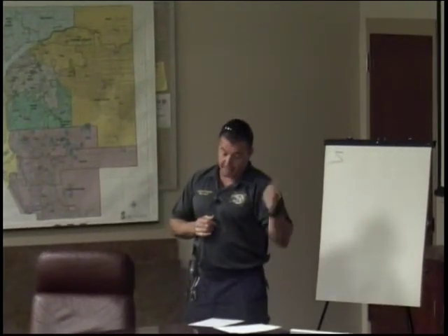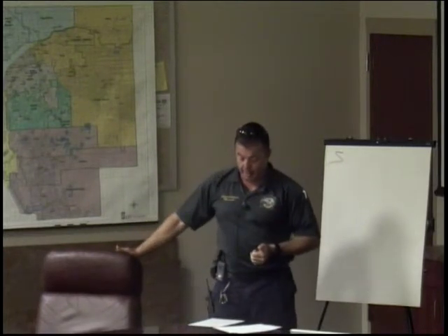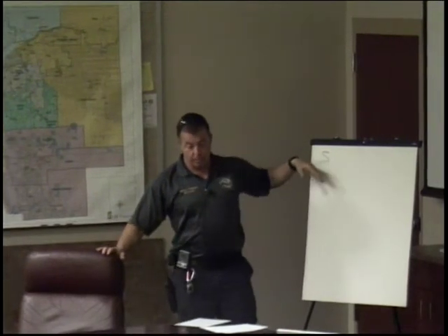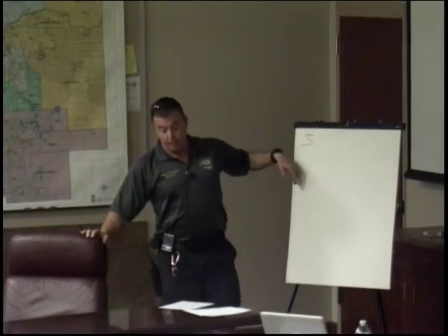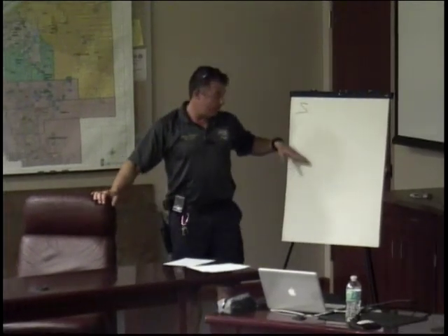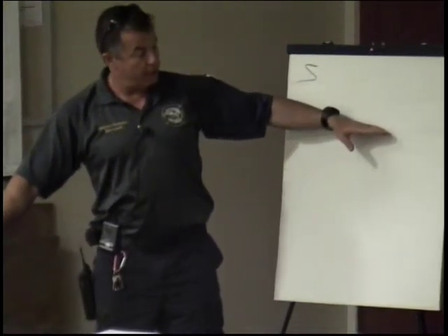Sedated patients, not even completely out, just sedated enough to change their mental status. You can throw them on and watch that. This is the one I needed the graph for, because you can watch the trends on a sedated patient. Their heart rate really doesn't change much. Their pulse ox doesn't change a lot, but you can notice the trends of somebody who has an impending respiratory event coming. That's sedated. Their respiratory rate slowly drops, but if you notice their CO2, it's constantly rising.